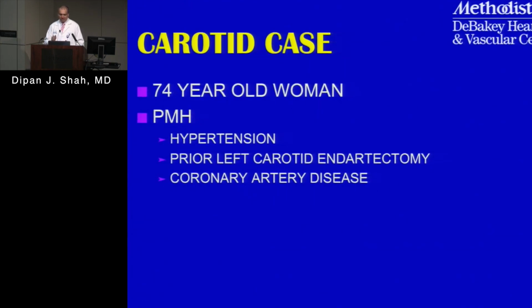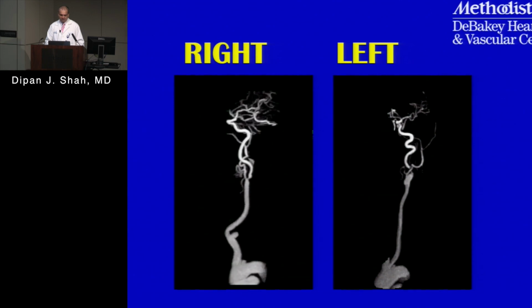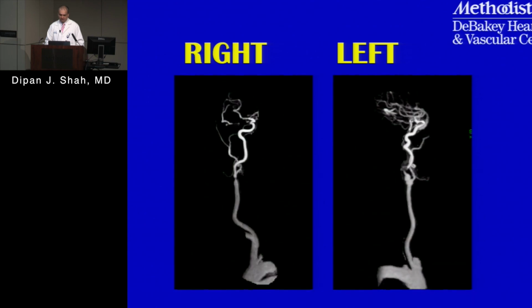74-year-old woman with hypertension, prior history of carotid endarterectomy, and a history of coronary disease, who now comes in for a carotid evaluation. So here's your right carotid. And here's your left carotid.